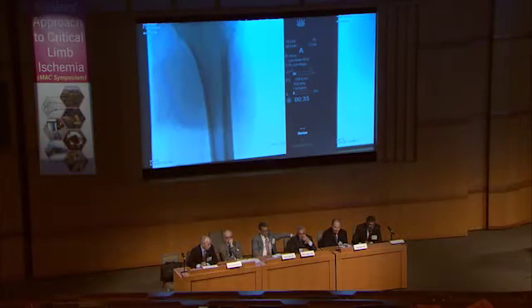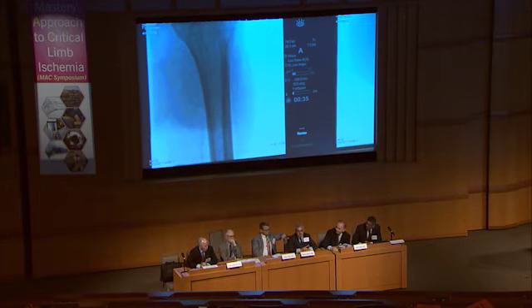I agree. I think John's practical suggestion is to go for the AT and take a final picture and maybe later see if you need to stent it. But John, if you were to stent it, what type of stent would you use? Size, I'd probably use a coronary DES and probably a 3.0 coronary DES there. Probably a long one, like a 38, Science or Synergy.